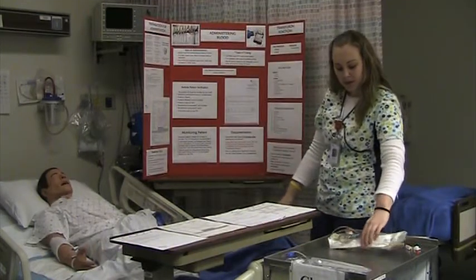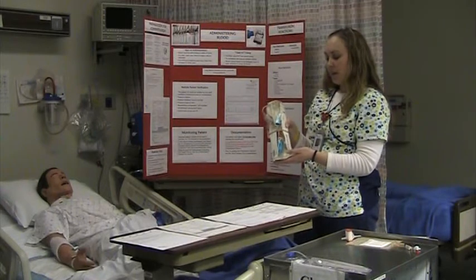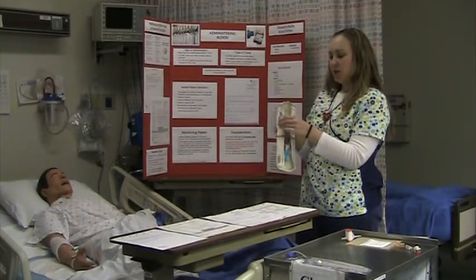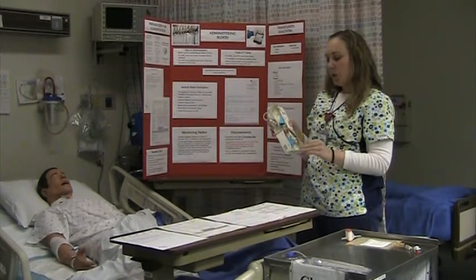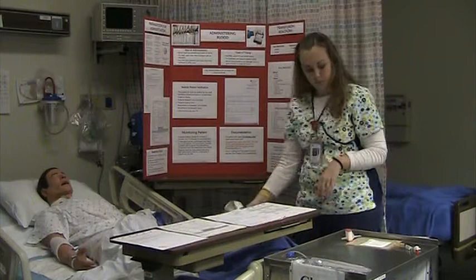Couple other tubing sets that we have here at Valley Care. This is a rapid blood infusion tubing. Here it has this pumping syringe that we can pump blood in really fast in case of an emergency, most often seen in the OR or ICU after heart surgery, okay?